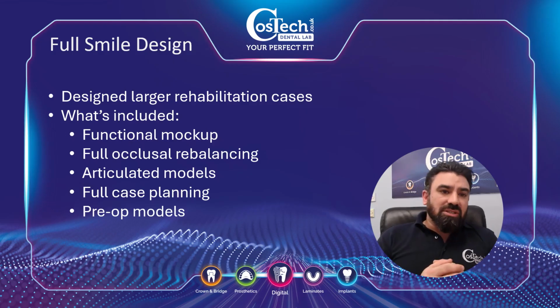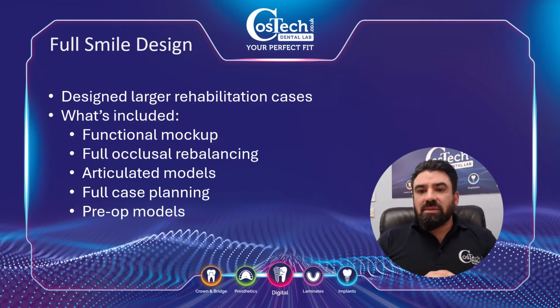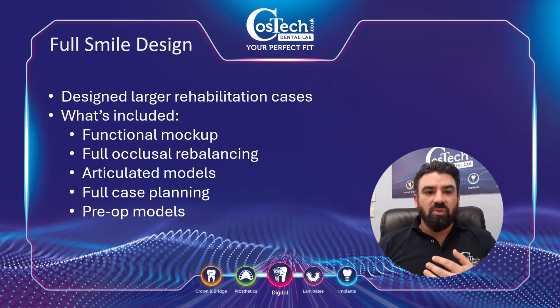The full smile design is, like I said, a massive topic in itself. Generally, we use this for very large, especially bite rehabilitation cases. People, heavy bruxists, who we're trying to rehabilitate the bite, if we're trying to increase the bite, and it's a lot more involved. Again, functional mock-ups, which we do as a standard design, because at the end of the day, it's the smile line that the patient is really wanting.